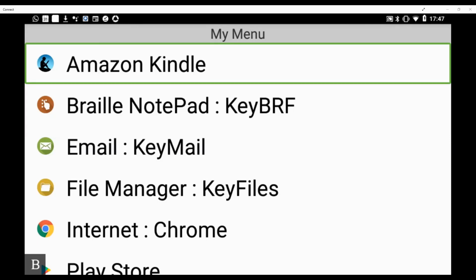Let's see what we have on the chat. Okay, I think there's a lot of chat that came in. I'm just going to stop sharing my screen for now. One thing that came in, somebody had mentioned that when you switch users, they wanted to use it in exam mode, and somebody could still go to the terminal and access the documents folder. That is absolutely the case.